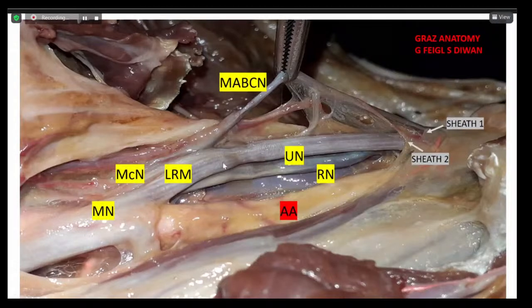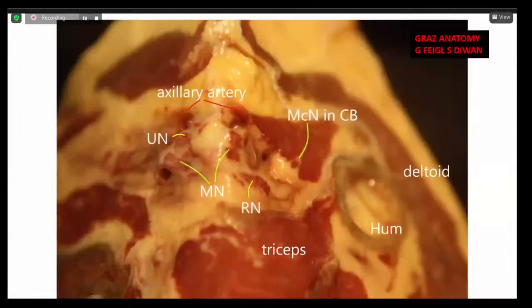And this is the reason why it has been mentioned that when you inject either at the median or ulnar, then there is a spread more proximal and a complete block of all these nerves. But when you inject at the radial, which is in a separate compartment, you can still see the thin slimy layer over the radial nerve. It's not totally bare. So all these were in one sheath, while this was in another sheath. And this is the one which goes right into the level of infraclavicular and still more proximal. Many times when we give infraclavicular, I saw a spread more subcoracoid as well as a spread more cephalad. So this is probably the reason why the blocks are inadequate when you just give at the level of the radial nerve.